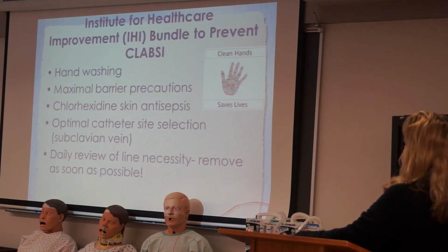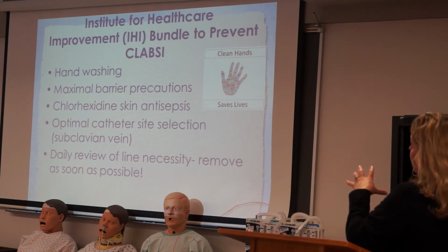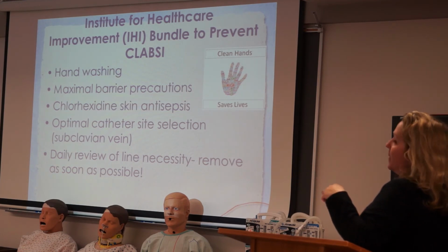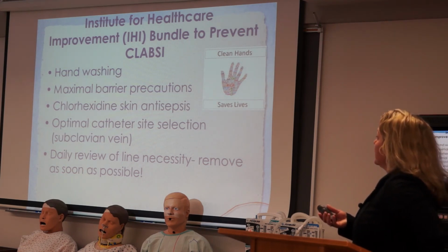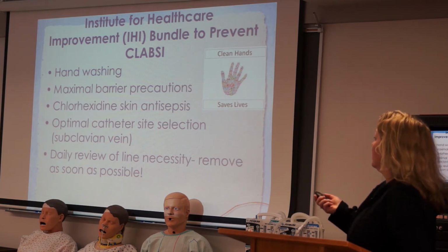So the Institute for Healthcare Improvement wants you to bundle together these things to keep the patient safe. Hand wash, maximum barrier precautions, chlorhexidine. Make sure you're using a good chlorhexidine when you're cleaning or changing the dressings. Catheter selection. Look at your lines every day.